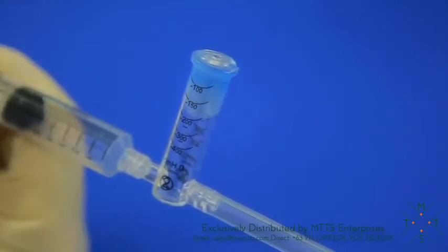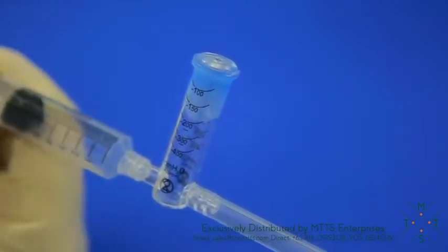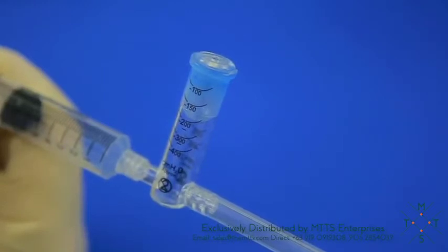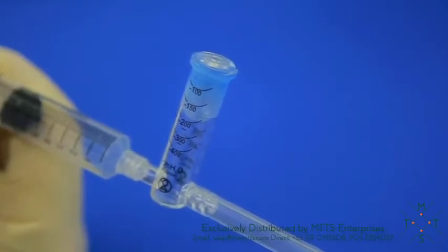Insert the capsule into the rectum to your desired depth in a neutral position and gently approximate the capsule to the mucosa wall until you see the blue diaphragm react.